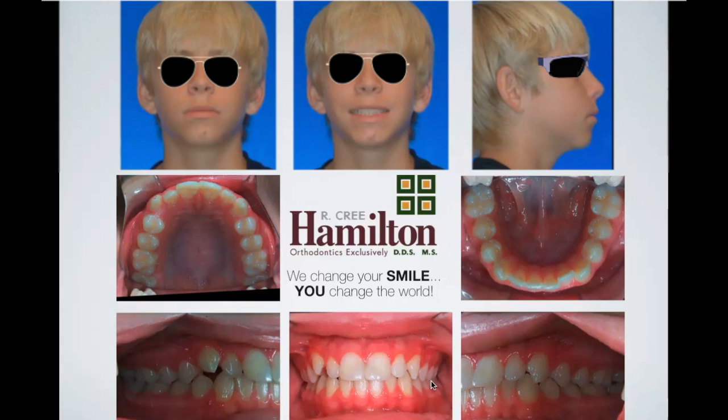So you can see here, now, was the jaw shifting due to the crossbite? Yeah, so definitely it's probably at least halfway back over from where it started, right? Now, with the expansion, let me see how I ask this. I didn't measure this out, right? At the time, we didn't even have cone beam. But do you think that our expansion was primarily skeletal or primarily dental? Yeah, one of those. And why?